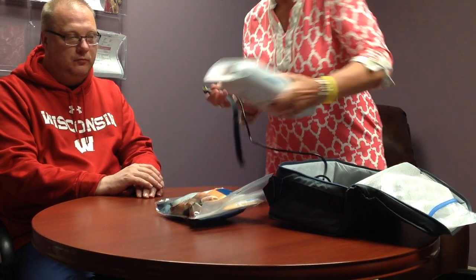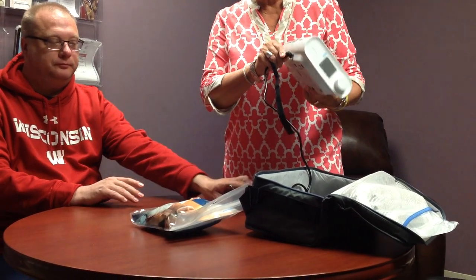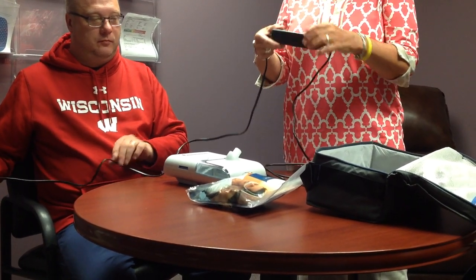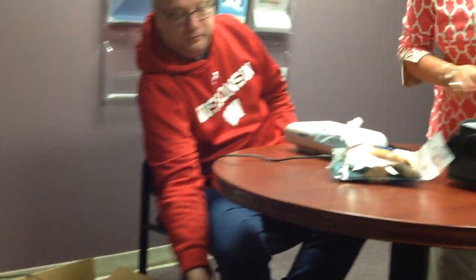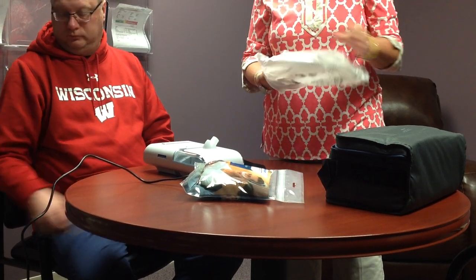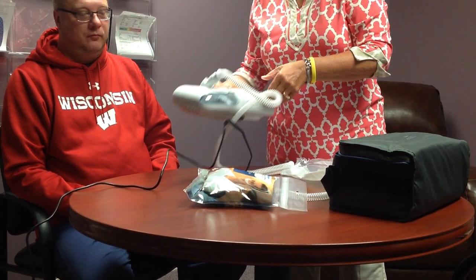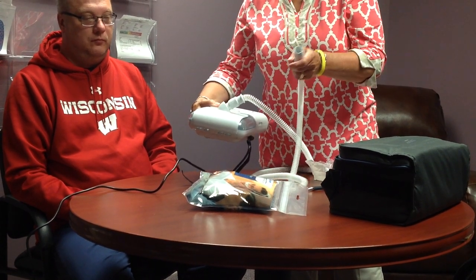This is green — we have color coded. There is nowhere else on this machine that it can be plugged into, but just so that you know: green with green. It does come in two pieces, just like your computer does at home — we have to have that transformer on there. You also have your tubing in here. This is a 15 millimeter tube, which is going to attach to the humidifier and also to your mask. Both sides are the same millimeter, so it doesn't matter which side you put into the mask or into the humidifier.